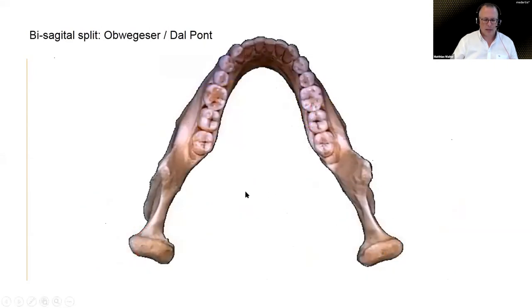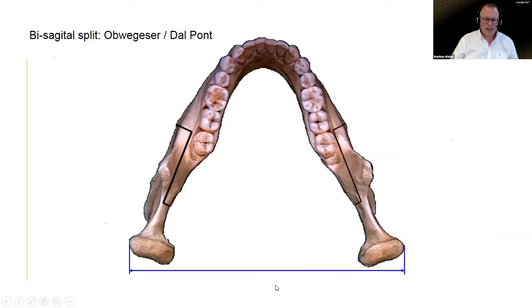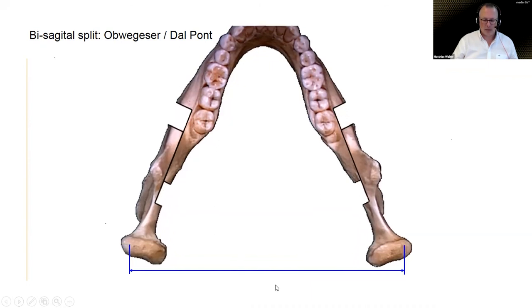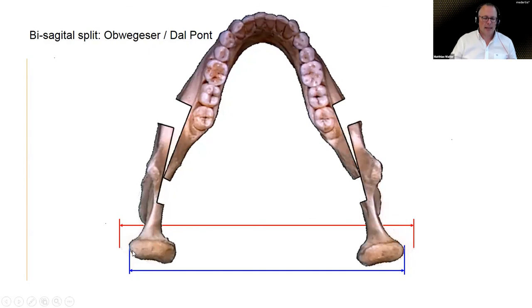Okay, so this is demonstrated here in a little animation. So I do this Z kind of oblique osteotomy. And when you transport now the body forward, you will now find that there is a certain effect. So there's a certain translation. So the further the jaw or the chin region is actually sort of transported forward, the more those condyles are actually forced in a new position. Can you see this? Okay. Now this new position would actually mean that your condylar heads are actually sort of pushed outward in the joint capsule of your fossa. That's very painful for the patient, and this is obviously not what we want to do, but what we want is to seat those condyles back into their original position.